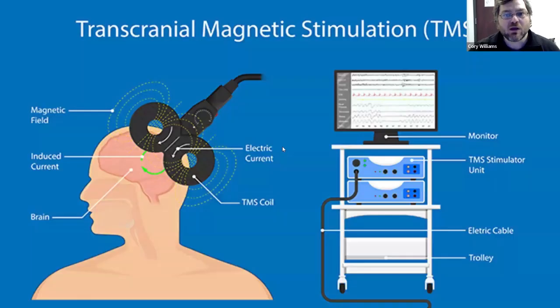Okay. So this is kind of what a TMS setup would look like if you added one to your office, although this isn't the only way to do it. Typically the client or the patient gets a coil that's placed over their head. This coil uses magnetic fields to target specific aspects of brain function. The coil plugs into the TMS power unit here, and there's usually a computer displaying output of some kind here. Different coils are shaped differently. This one here is a figure 8, as you can see, because it's shaped like an 8. But there are other types too, depending on the different producers and manufacturers.